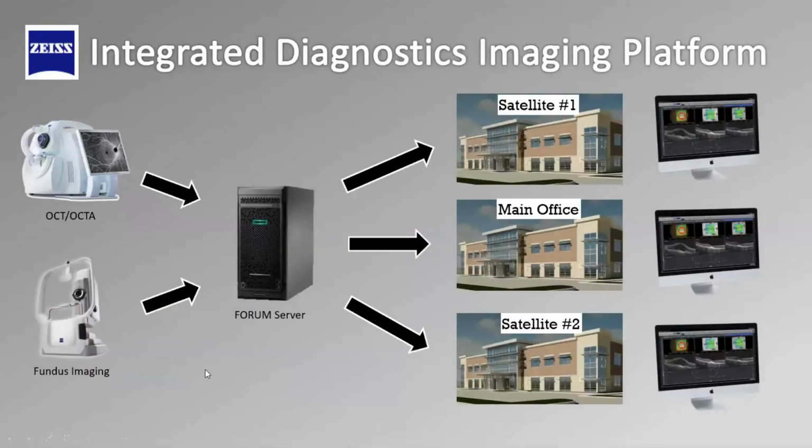This is how the Zeiss IDI system infrastructure is set up in our practice. We obviously have many OCT and OCTA devices, as well as a plethora of fundus imaging devices. And these, I should note, are both Zeiss and non-Zeiss devices, although we predominantly have Zeiss devices. And these devices all capture images and create DICOM files, which then are transferred to our Forum server, which is our sort of single repository of our retinal images and helps manage all of our imaging data. The Forum server then communicates with all of our offices.